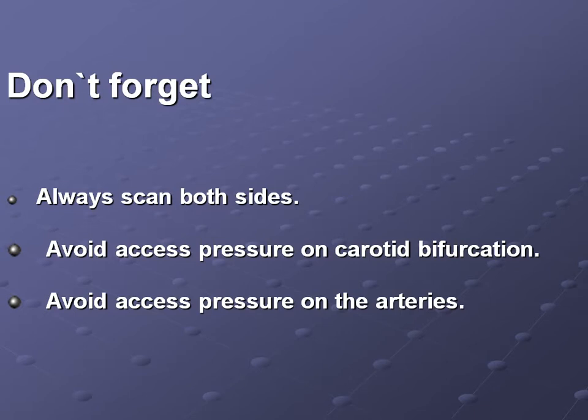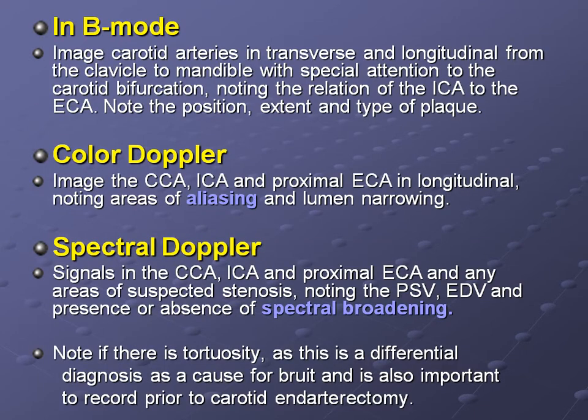Always scan both sides, and avoid excess pressure on the carotid bifurcation and the arteries, because excess pressure on the carotid bifurcation might cause abnormality at the carotid body, which might change the hemodynamics of the cerebral circulation. Sometimes, if there is a plaque, it might rupture and cause distal thromboembolism.